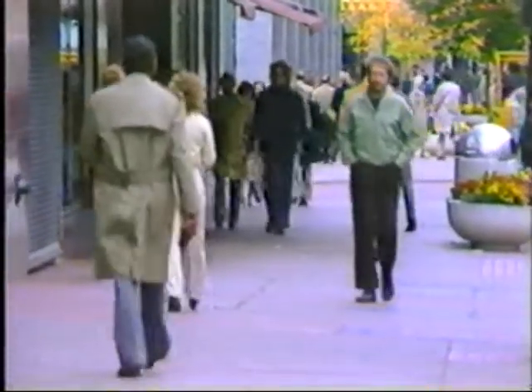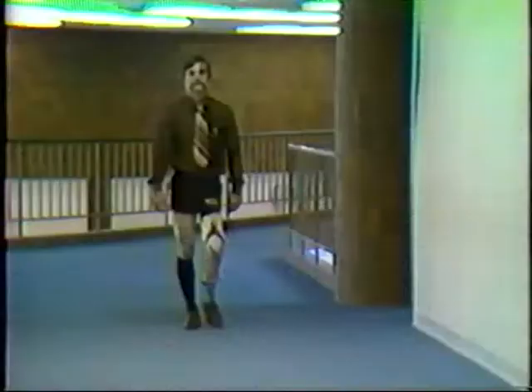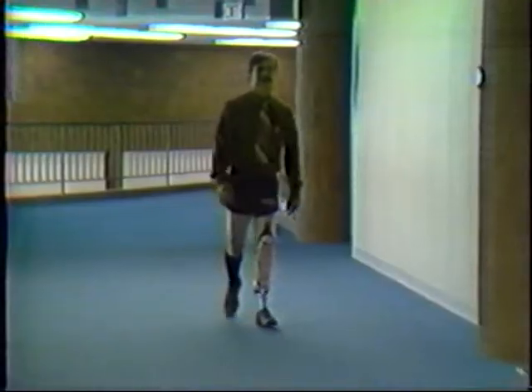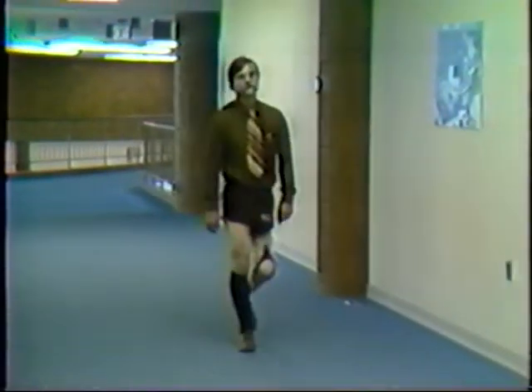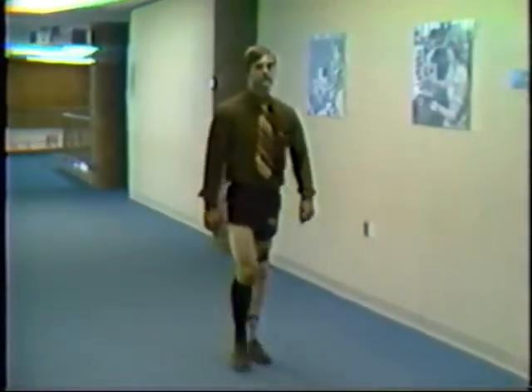Normal human locomotion is a complex process. Unfortunately, we often discover its beauty only after it's taken away by disease or injury. Restoring locomotion for the amputee becomes a primary goal for the prosthetist. To accomplish correct dynamic alignment, you must observe the interaction of the socket, pylon, and foot at mid-stance as the amputee walks.